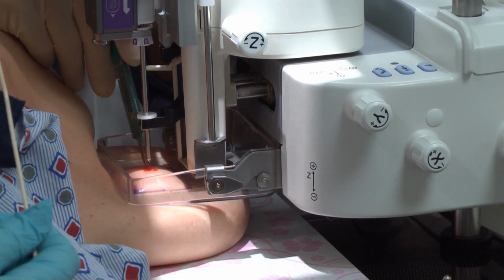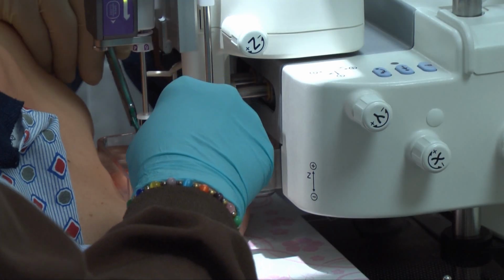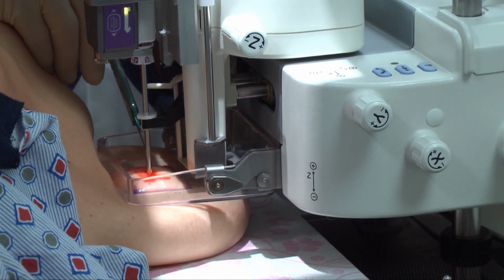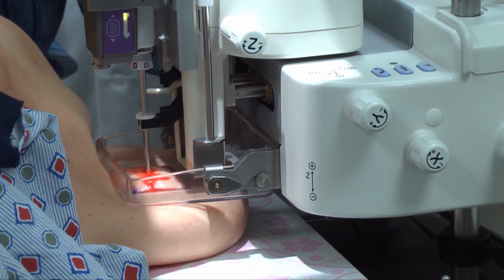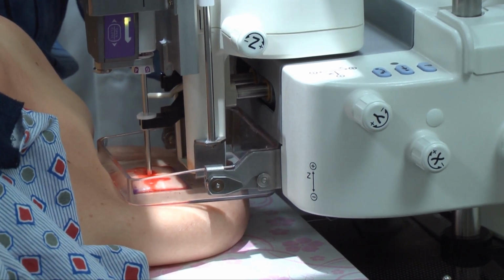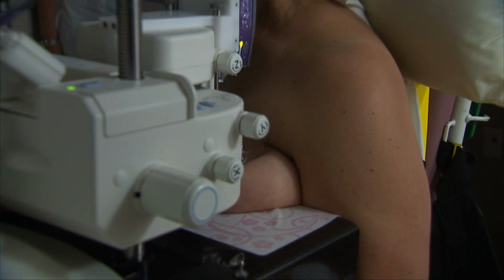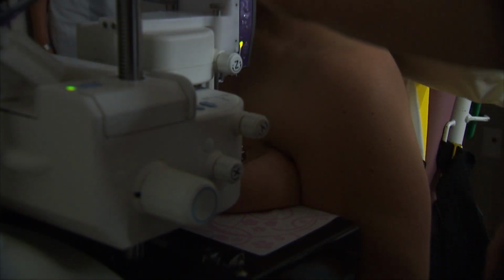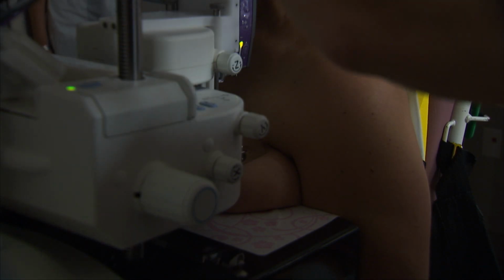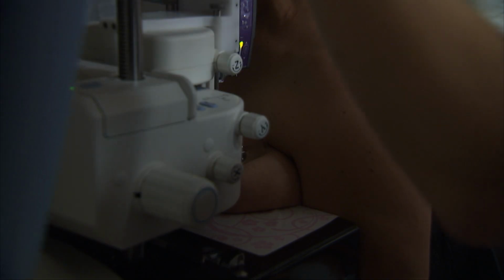And I'd rather be too small than too big to begin with. Okay, so we went in, and now we're going to go to Z0, and we're going to take our images pre-deploy. We're taking the minus 15 degree image first, and we'll see where we are here. We're heading right for the calcifications. So this is the pre-deploy. You never cheat. You always take your pre-deploy and your post-deploy.